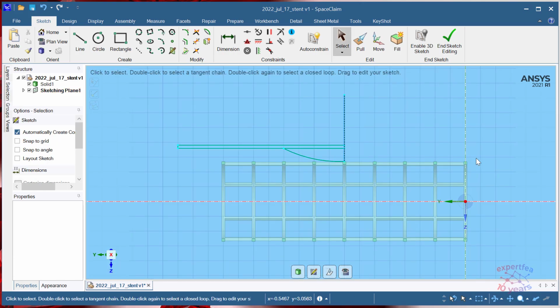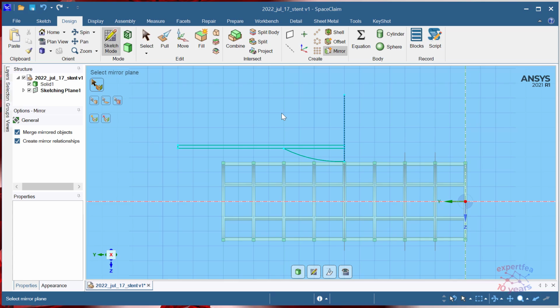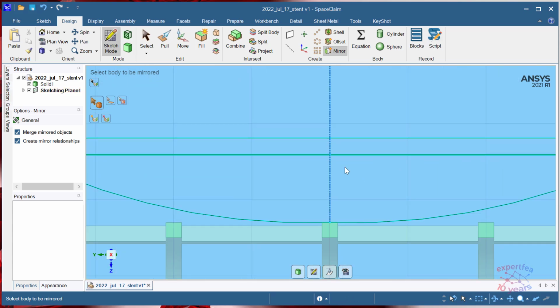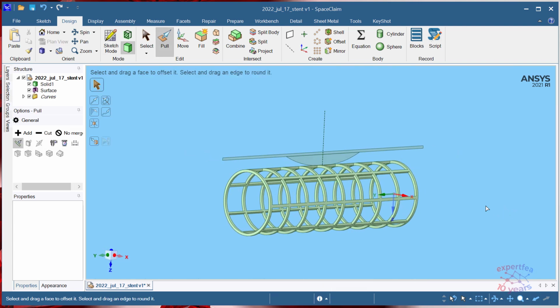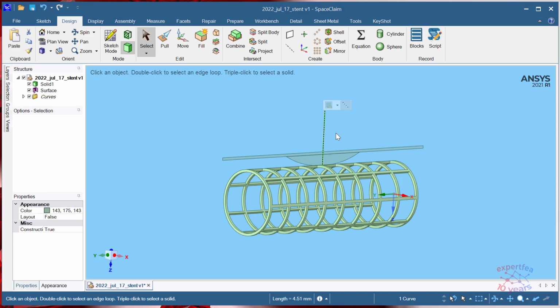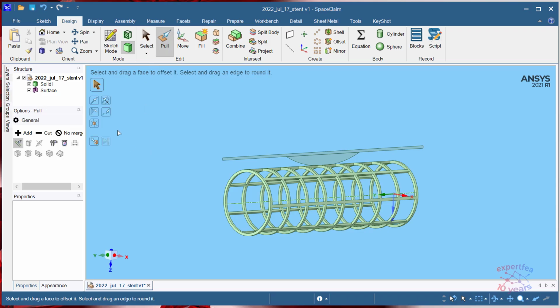Let's mirror everything in order to have the entire assembly. Mirror, it asks for a plane. Let's select an axis. Now we're going to select everything, and everything is mirrored. We have this plaque, the blood vessel. Let's go to 3D. Then we will execute a Revolve command. You can click the unneeded line, delete. Yes, pull. We have the Revolve option.